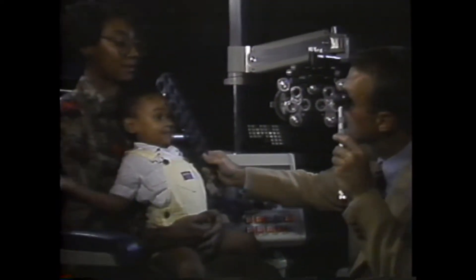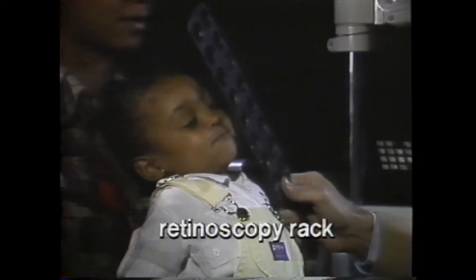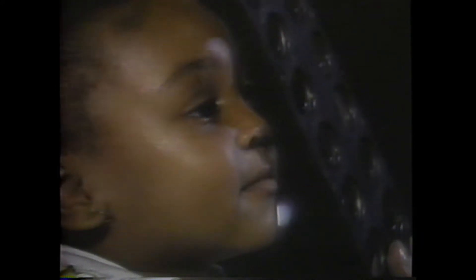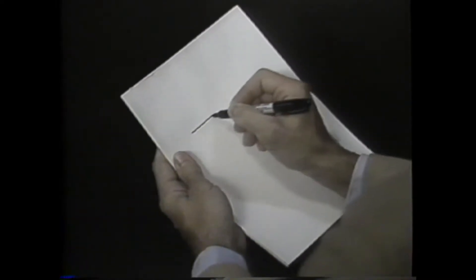Some retinoscopists like to use so-called retinoscopy racks for the refraction of young children, especially for examination under anesthesia in the operating room, where complete trial lens sets may not be available. In this case, each principal meridian is neutralized with spheres only, and the results are usually recorded in the form of an axis cross.